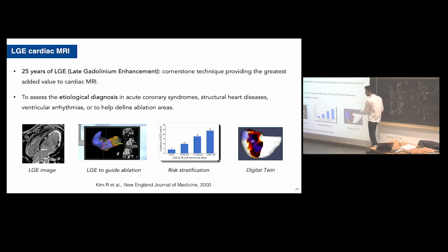So the cardiologist doesn't have to try many points, but knows, thanks to these digital twin models, where to ablate the patient. So this is very useful. And yesterday we talked about animal experiments. This could be one solution to also avoid animal experiments, right? Build digital models of the experiments.